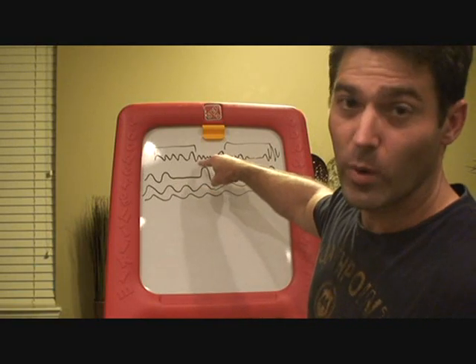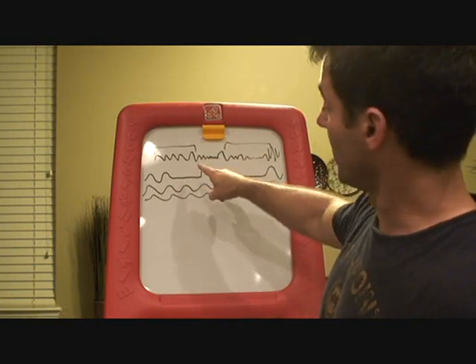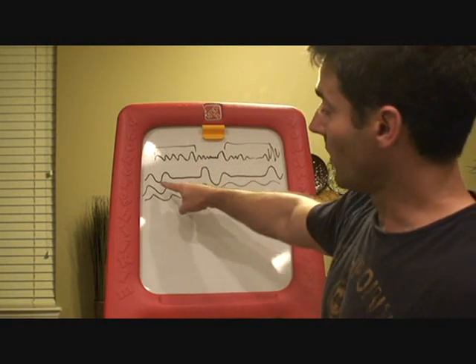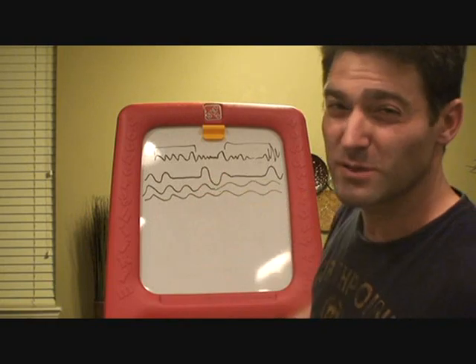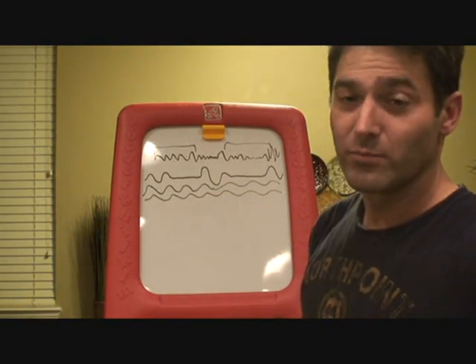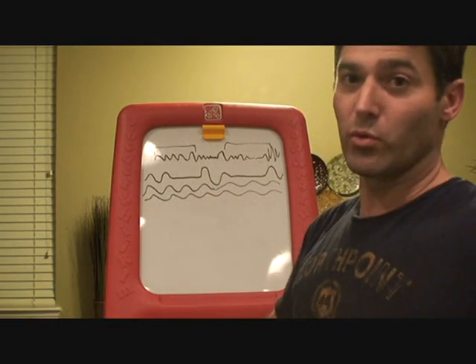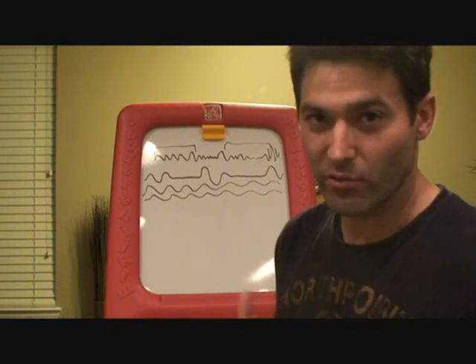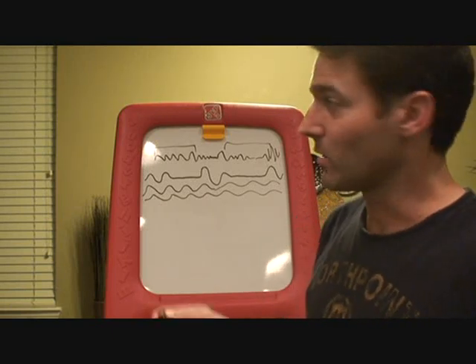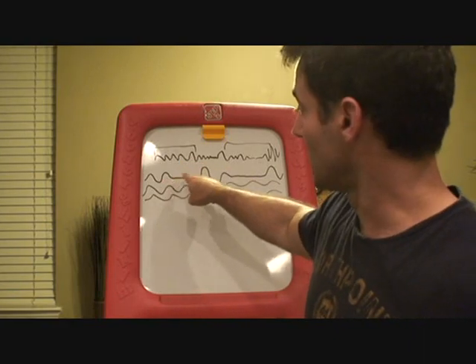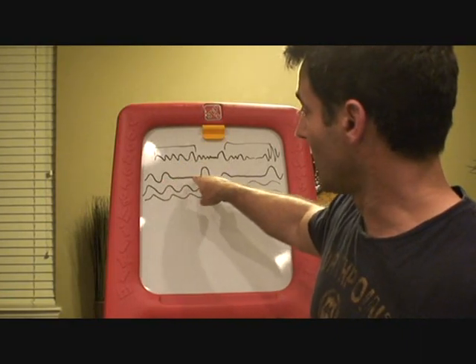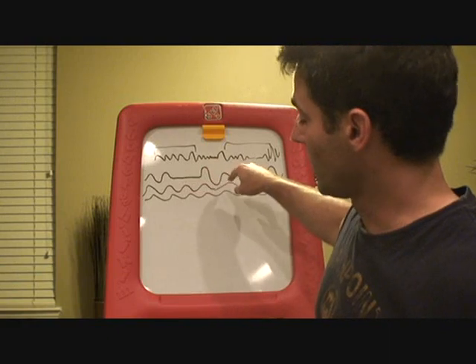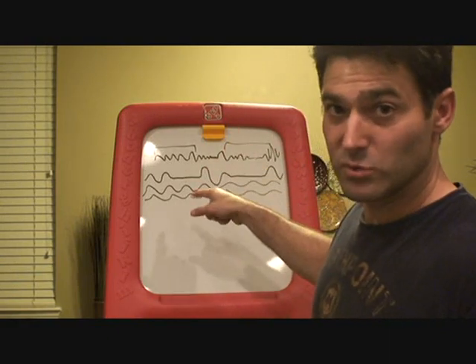Then right in here they're going to wake up. And oftentimes if they're severe, they're going to stop breathing again. These belts tell us it's obstructive because they're trying to breathe — thrusting their chest and abdomen trying to draw in breath. But because there's an obstruction, they aren't able to breathe until finally they wake up and start breathing again. That's obstructive.